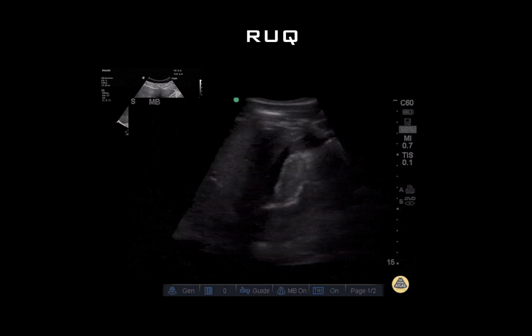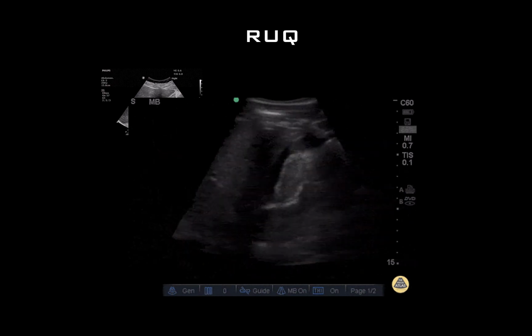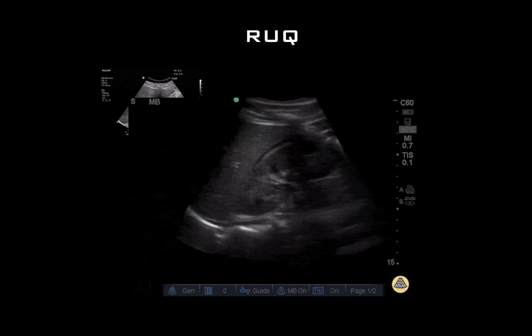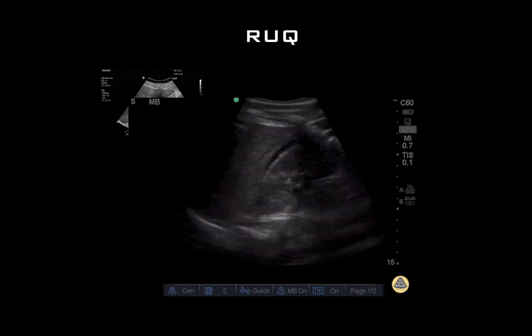If you have a post-lytic patient that is tachycardic with a hemoglobin of 50 and a hyperdynamic underfilled LV and a small collapsible IVC, this positive FAST is going to be a lot more useful rather than an isolated finding. Use this as a data point and clinically integrate it into your decision making.